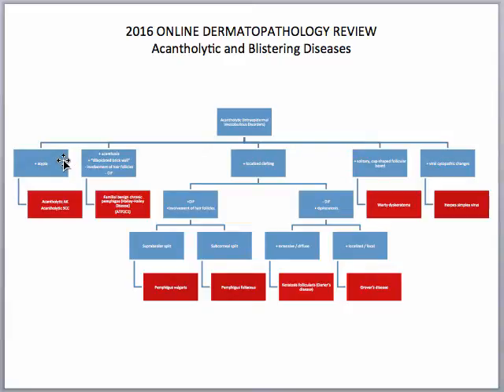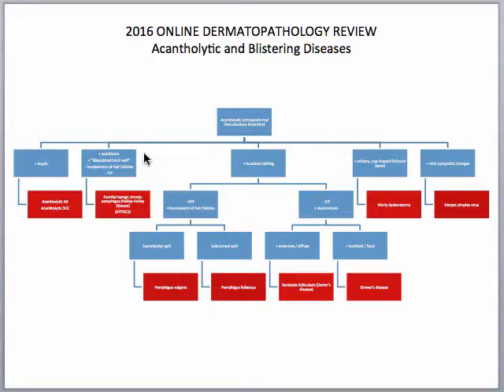If you see keratinocyte atypia, you want to think of an acantholytic AK or an acantholytic squamous cell carcinoma. If you see acanthosis with a dilapidated brick wall appearance that has no involvement of perifollicles and a negative direct immunofluorescence, you would want to think of Hailey-Hailey disease. The dilapidated brick wall appearance simply refers to the fact that acantholysis is happening at all layers of the epidermis, resembling a dilapidated brick wall.